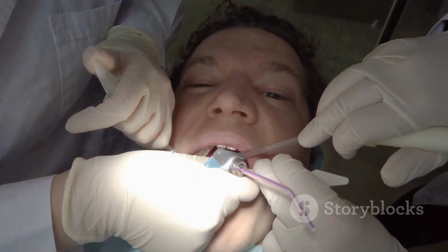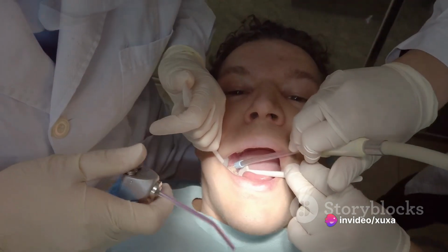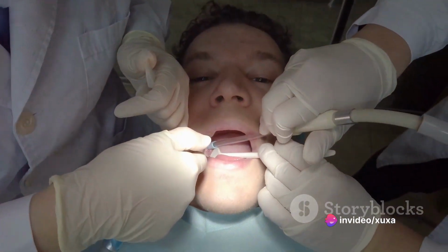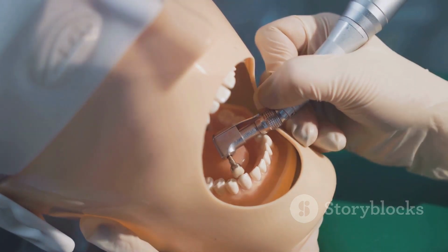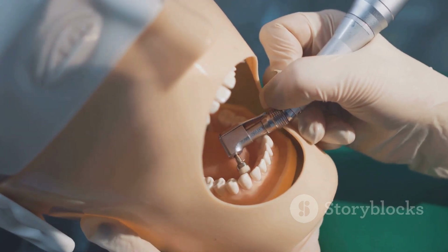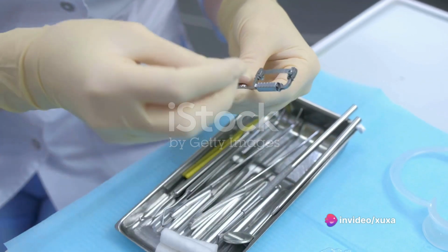Unwanted remnants of the pulp chamber's roof could darken the tooth crown. Furthermore, failure to locate the canals can lead to persistent endodontic disease. Several factors contribute to endodontic failures, including diagnostic errors and inadequate treatment planning. Lack of familiarity with pulp cavity anatomy is another common culprit.